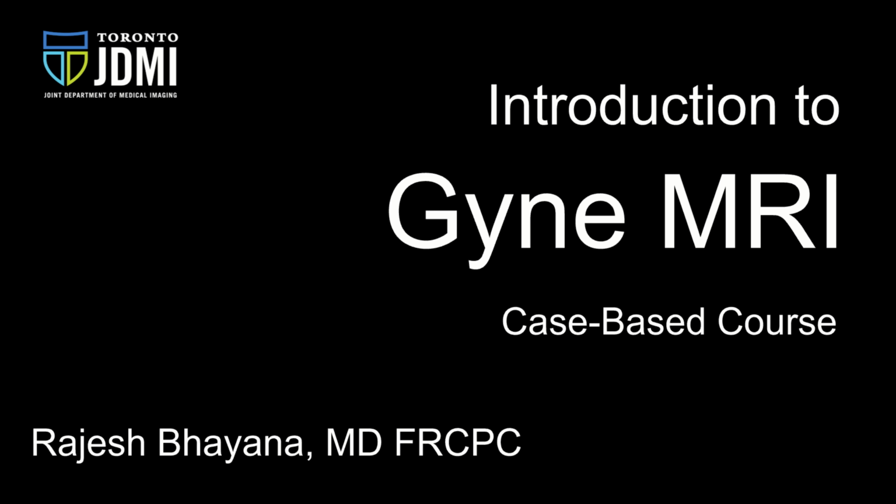This is an introductory video, part of an interactive course designed to teach you how to read MRI of the pelvis in females. By interactive, I mean that you'll be able to scroll through full MRI pelvis cases representative of the most important pathologies and learn everything that you need to know about each pathology. This includes walkthroughs of the most important MRI findings and MRI pearls.